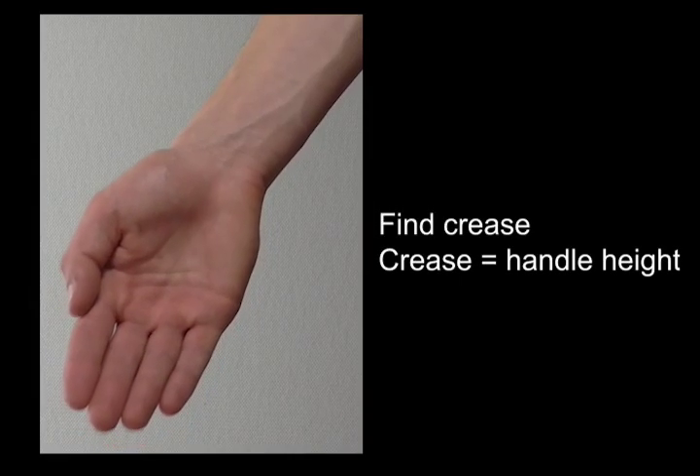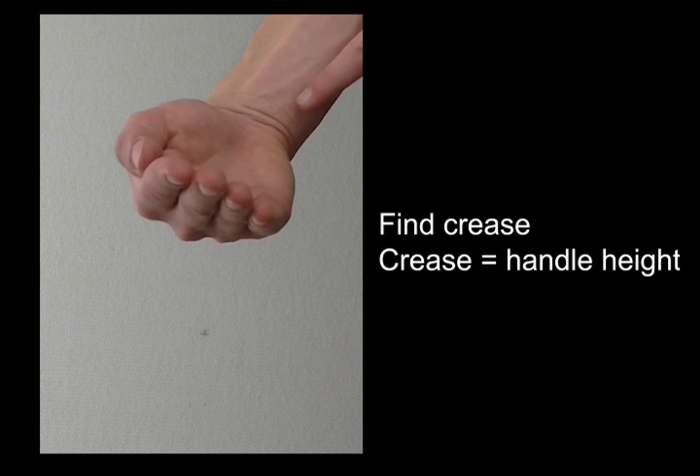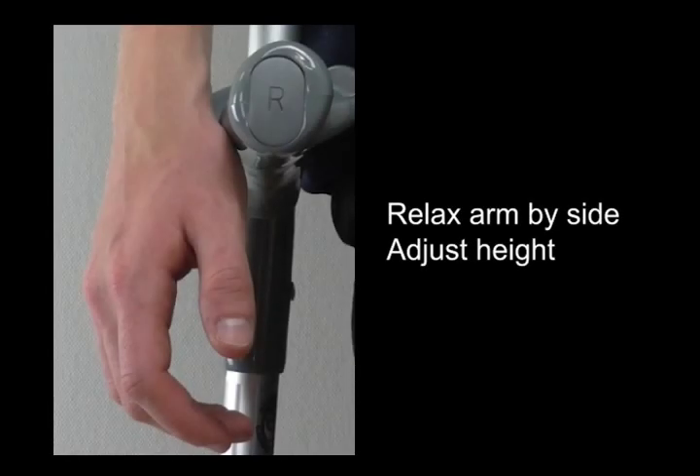If you bend your wrist, you will find that your skin creases just above the wrist joint. This is the height that you want to have the handle of your crutches. Stand with your arm relaxed by your side and make sure that the handle matches up with this position on your wrist.